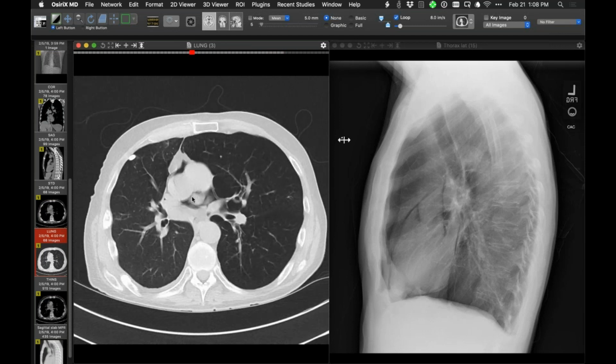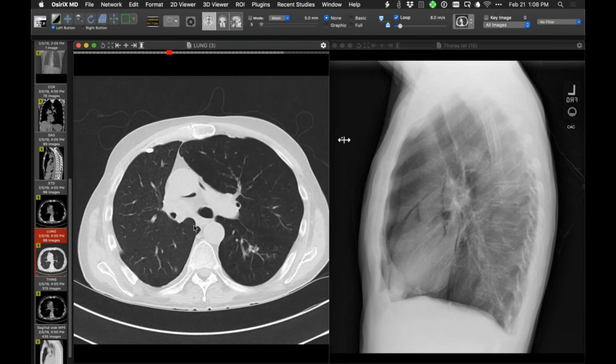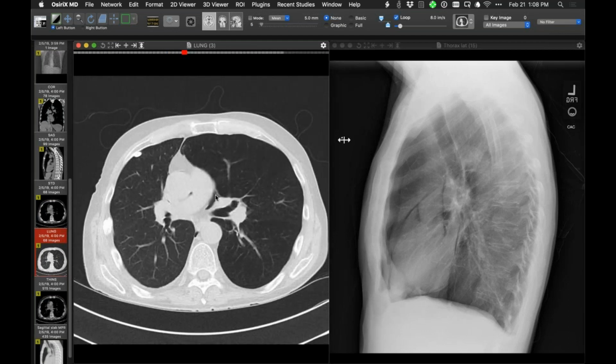Because we had a similar case just this week, and when they do the anastomosis, the vascular anastomosis, it's often intrapericardial, at least the venous component. So it's not uncommon to see pneumopericardium after a lung transplant. Right. So let's look at that. I just hopped on. I agree.